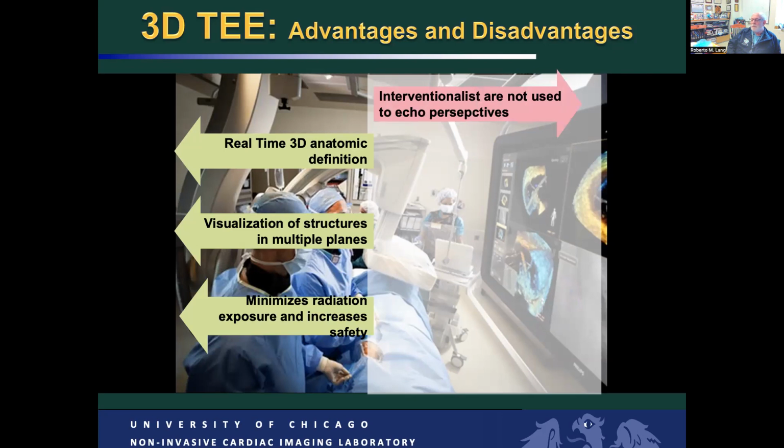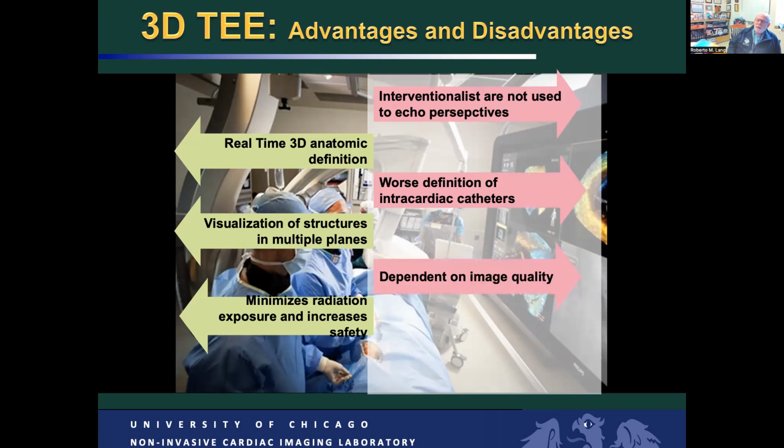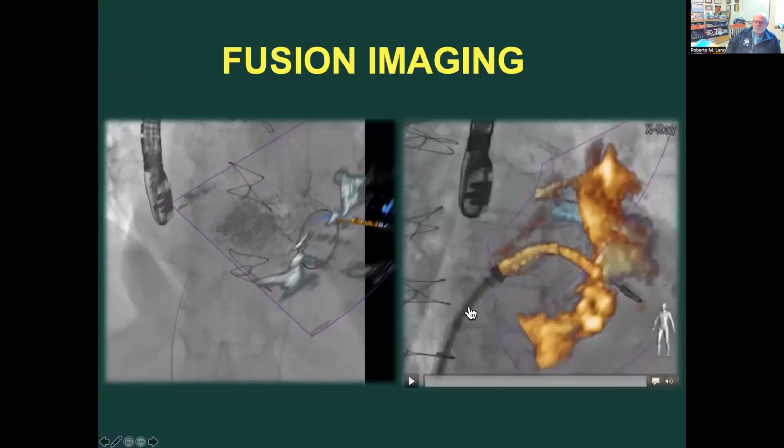Part of the limitations of using 3D echo here is that many interventionists are not used to these echo perspectives. 3D echo at times gives you a worse definition of intracardiac catheters, and 3D echo is, of course, very much dependent on image quality and operators' experience.